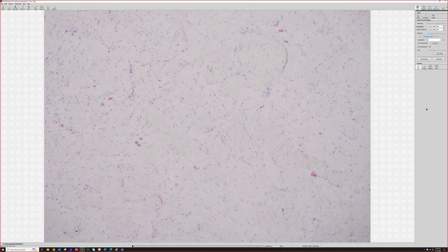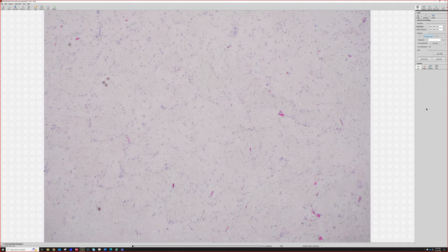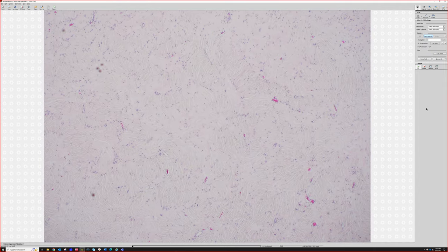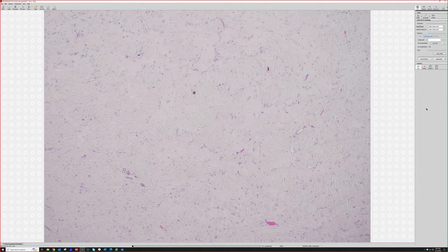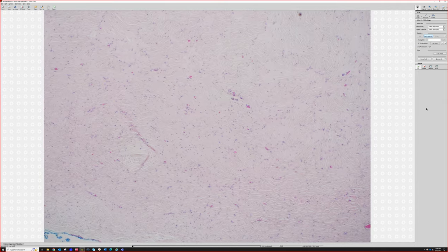I feel like you see that sometimes better if you have a light microscope and you can flip the condenser. It makes three-dimensional things and spaces stand out better. So you look without, then with it turned on. I think it's better. You can decide what you think. And it's hypocellular bland spindle cells, dense collagen, cracks and swirls, okay?